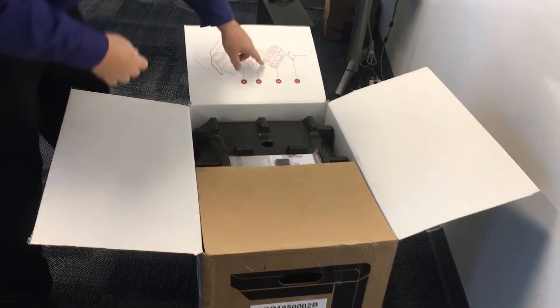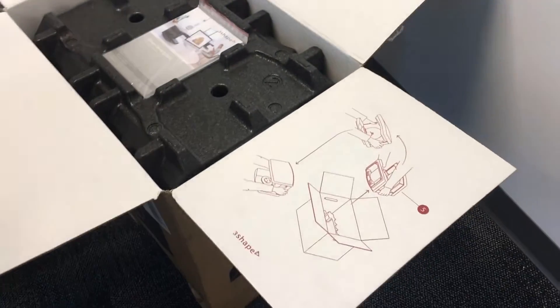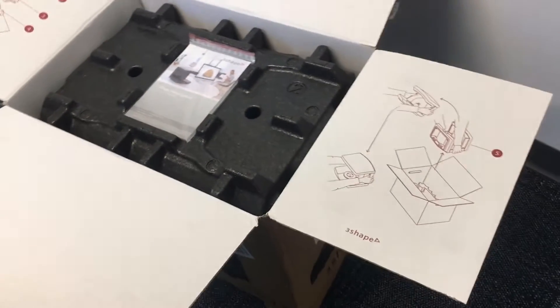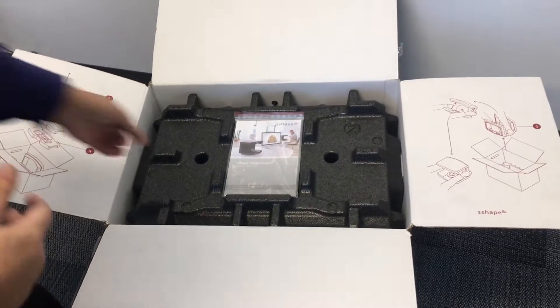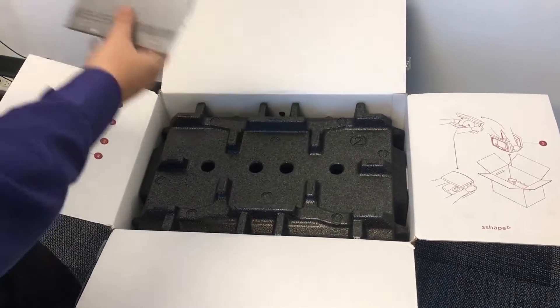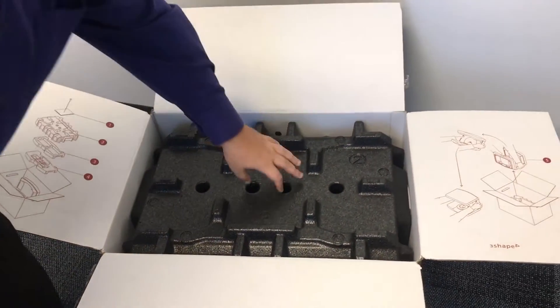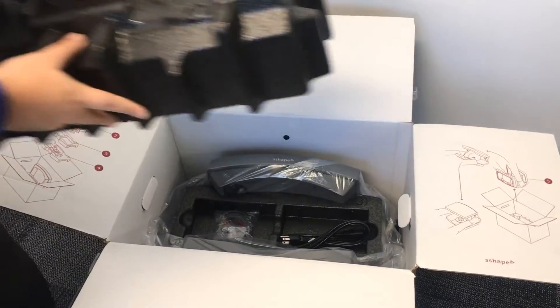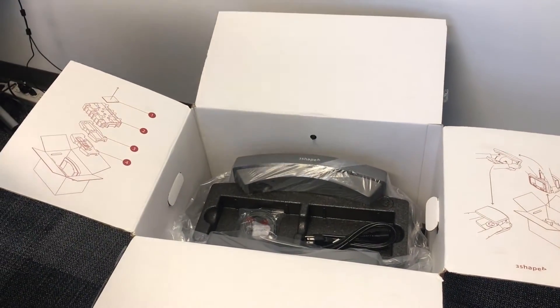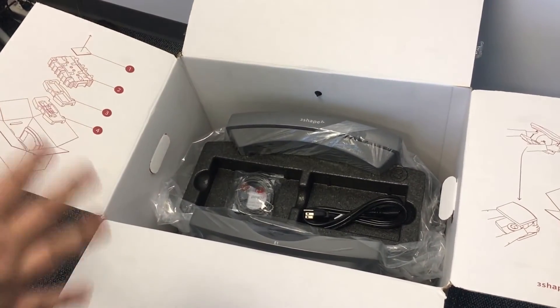Opening this up, right off the bat it looks like they've included some unpacking instructions — that's fantastic, that's going to make everything a lot easier. It's also going to make it easy to repackage it if we ever need to move the scanner for any reason. On the very top, we have our 3Shape Dental System Safety Setup Guide as well as some shipping information. Going further, we're going to remove this big foam piece.